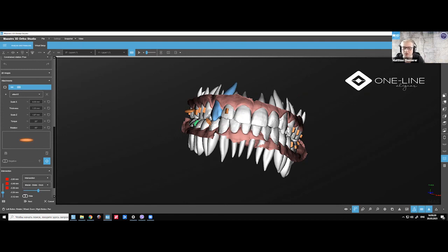Also, often a question: do you make the etching guide out of this, or would you say it's not necessary? No, I don't think it's necessary. I tried once, but I think it's an extra step, and the chances of the attachments falling off are higher. Anyway, when you want to make a little more area of attachment for the acid etching, if you make it exactly at the place and for some reason it didn't come in, it's an extra step for us to make in the lab and for the assistant, and the chances of coming off are higher.